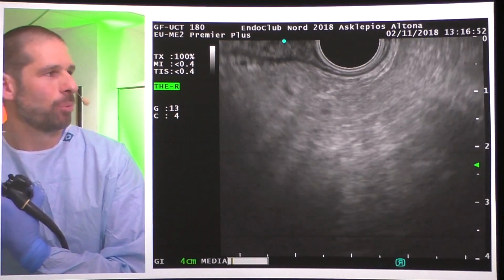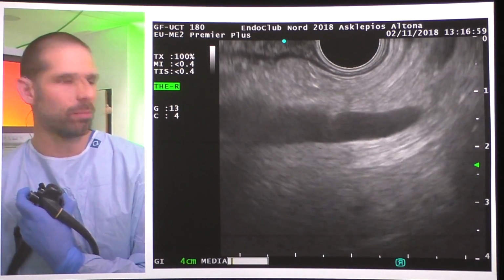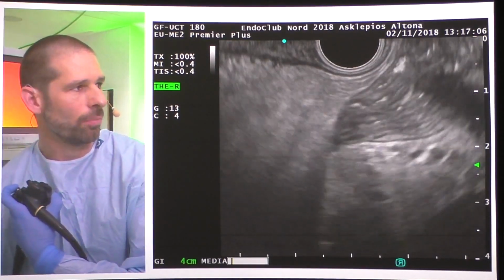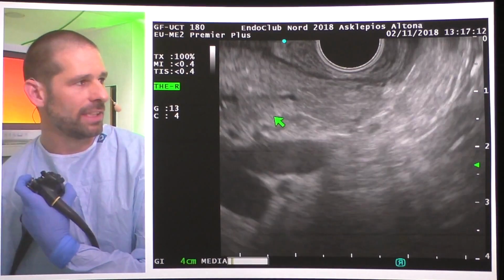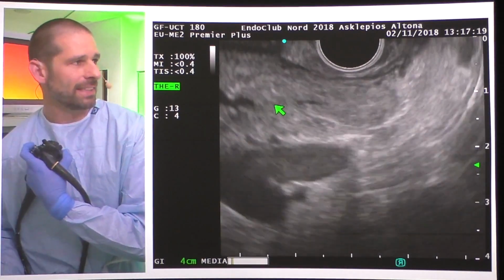Otto in the procedure. Hello everybody, we look at the endoscopic ultrasound. The point is on the left and on the right. We are in the distal duodenum, just to give you an orientation. Here you see the superior mesenteric artery, and I would pull back to see the pancreatic head. Here is the processus uncinatus, and often you don't see the duct so nicely.